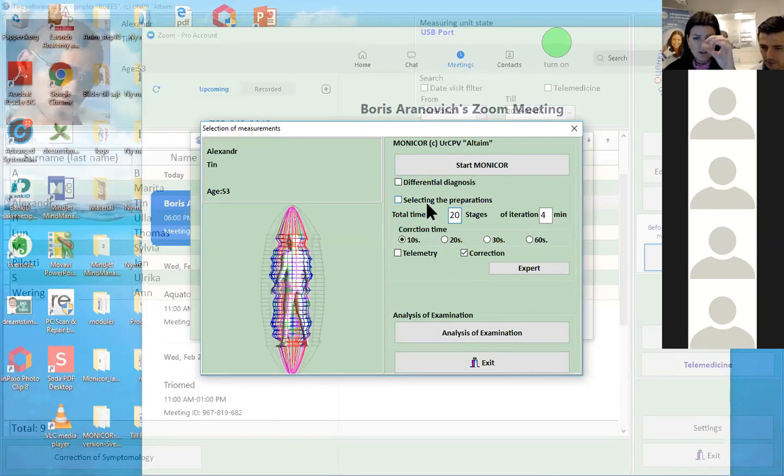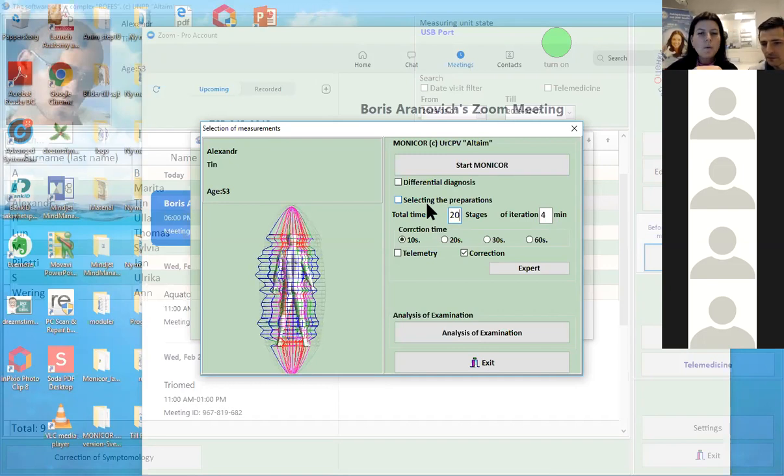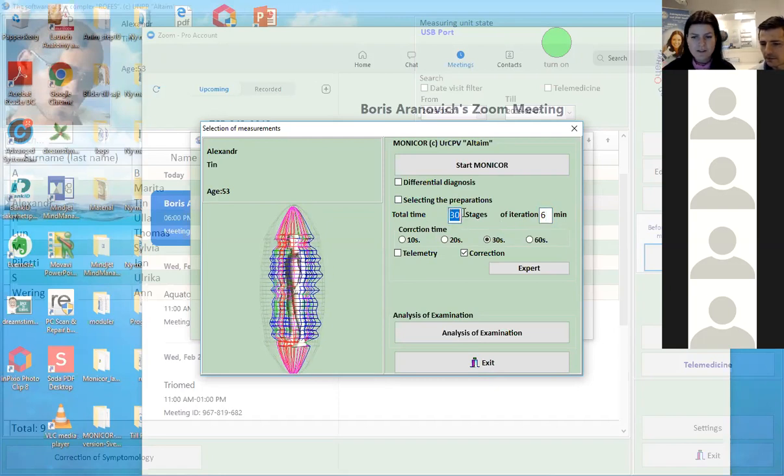If the circle, the first one with meridians, is very, very small, then probably it should be started from 15 minutes for the first treatment. So you write down 15 stages or whatever. Total time 15, and stage of iteration you can leave at 4. As you do more and more, 30 minutes, probably every 6 minutes you have to do this kind of measurement.